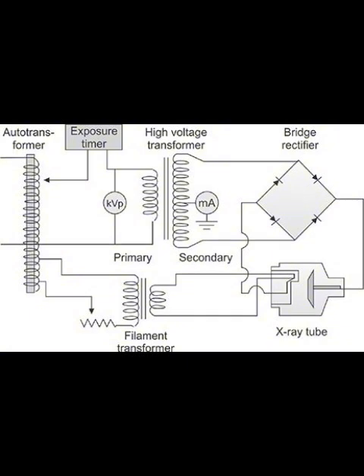So the ideal scenario, electrically speaking, is to have this really stable, almost flat waveform powering the tube. That's the goal, yes. As smooth and consistent as possible. And what's the payoff? Why strive for that perfect waveform? Well, the big picture here is that a stable waveform produces consistent X-ray exposure. Every pulse is like the one before it. This directly leads to better image quality, less noise, better contrast, and importantly, it helps reduce the radiation dose to the patient.